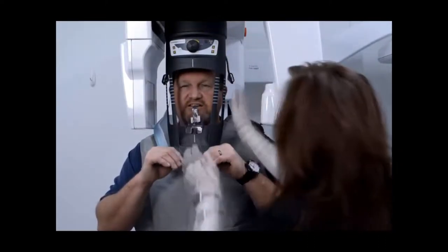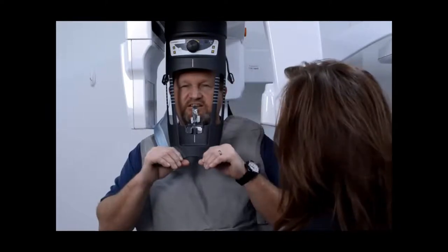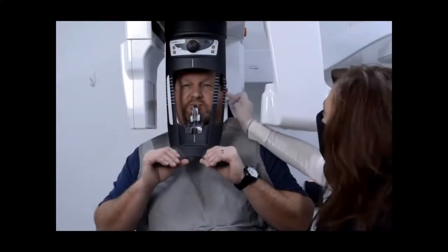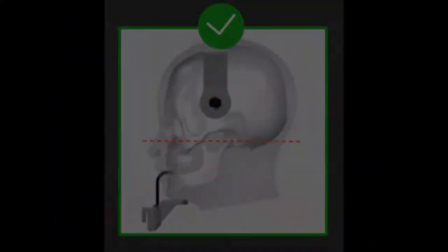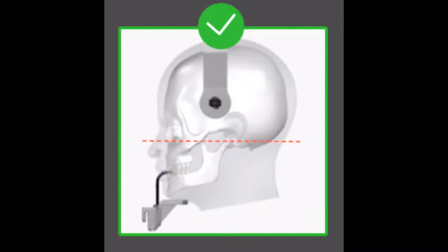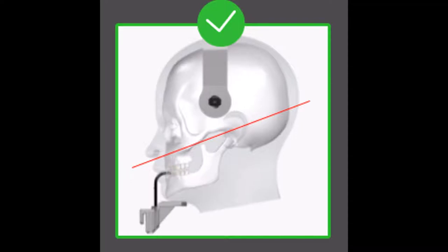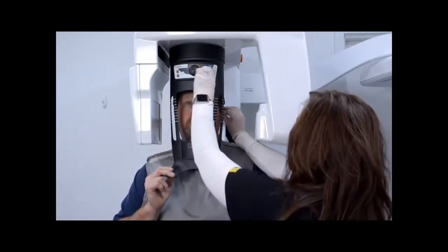Ask the patient to rest both hands on the lower handles of the head and chin rest. When the patient is properly positioned, push the temple support back to match the patient's temple area. Turn the adjustment knob clockwise to close the temple supports and use the horizontal positioning indicators as a visual aid to adjust the up or down inclination of the patient head for a Frankfurt plane horizontal alignment.